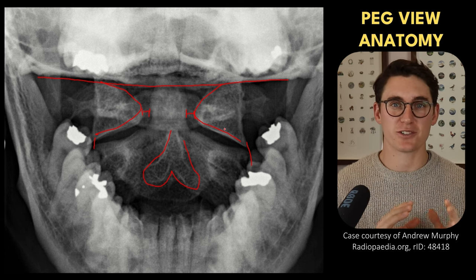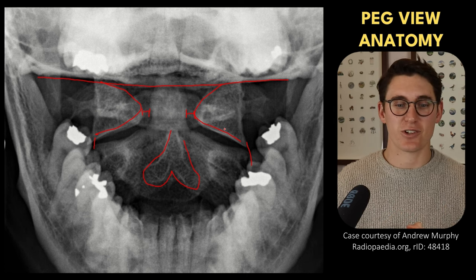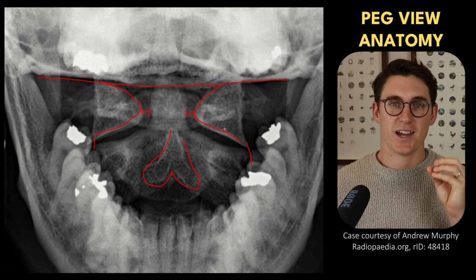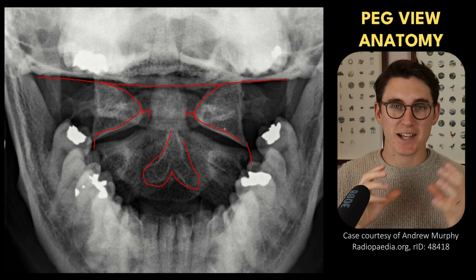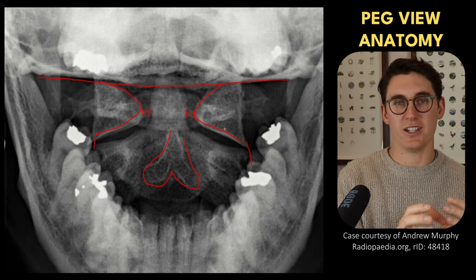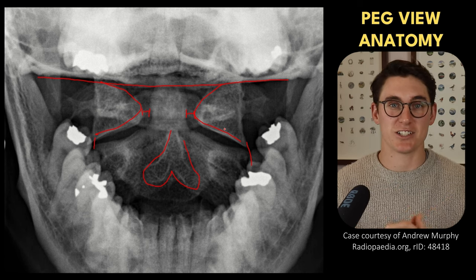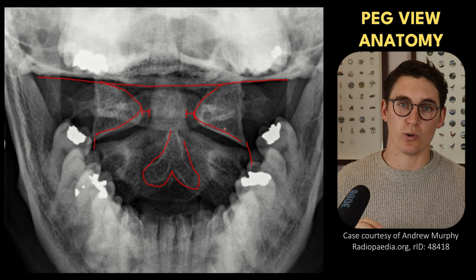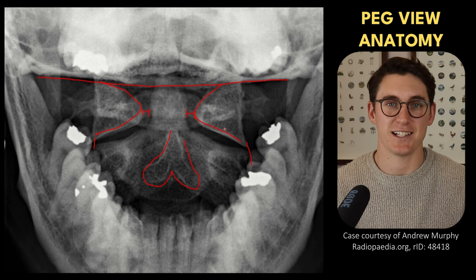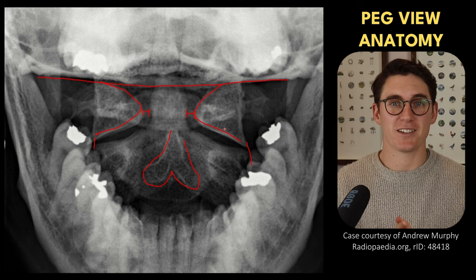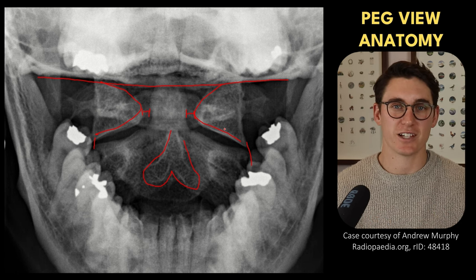So we've looked at our lateral view, frontal view, and open mouth view. The most important thing when assessing a cervical spine x-ray is checking for good alignment of the bones, then systematically looking at each portion of each vertebra. Because the anatomy all overlies one another, we need to go through the regions systematically: vertebral body, pedicle, transverse processes, pars interarticularis and facet joints, then lamina heading back towards the spinous processes. If we go through the cervical spine x-ray systematically like that, we're much less likely to miss anything. And if you remember one thing: look at the surrounding soft tissue — that can often be the clue that something sinister is happening within the bones.